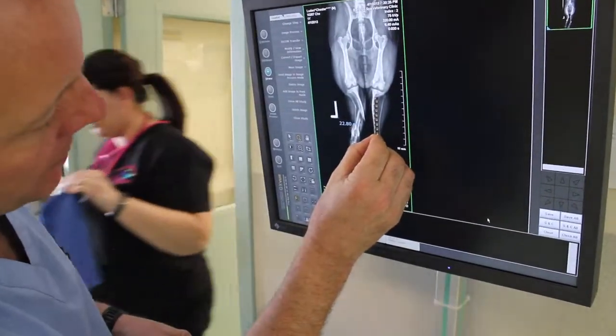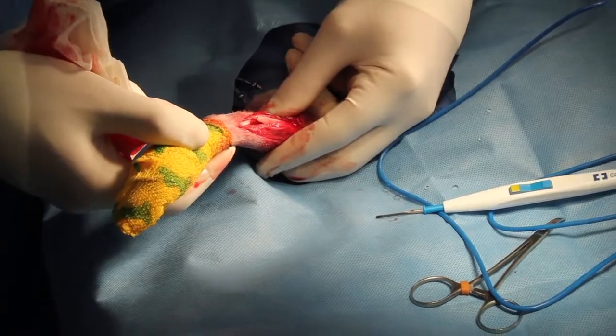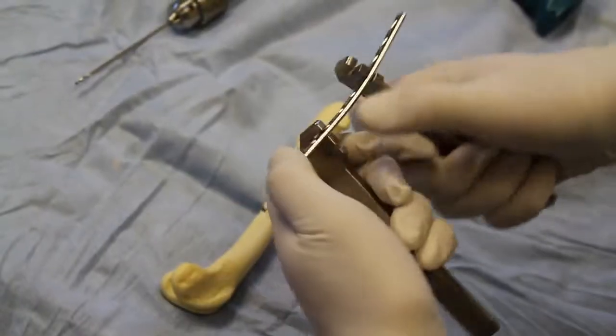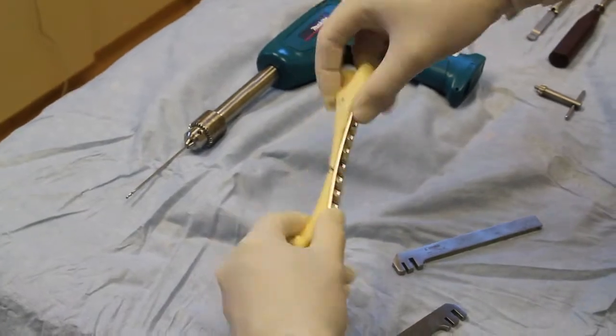During surgery, the bone fragments are accessed and reduced, or put back together, then held in place with bone clamps. The pre-contoured plate is held to the bone to check contouring, and adjustments are made as needed. The contouring must be perfect for a good outcome.